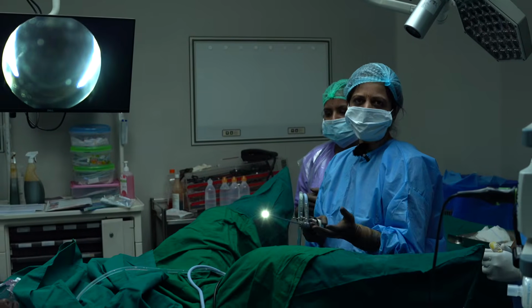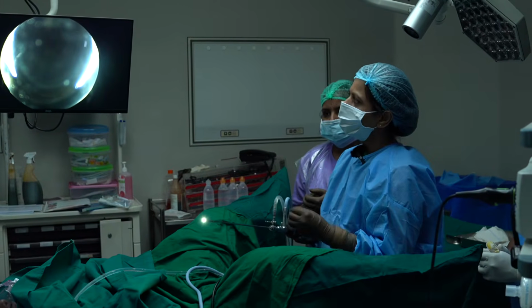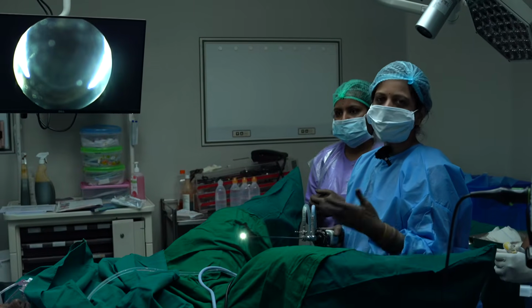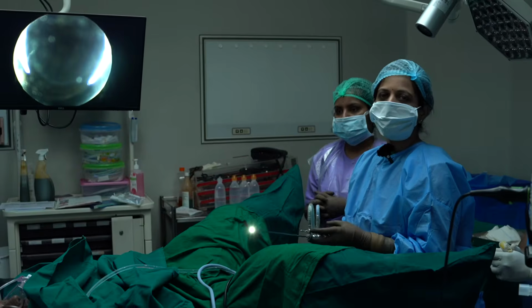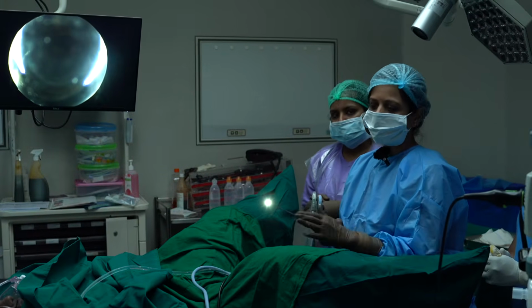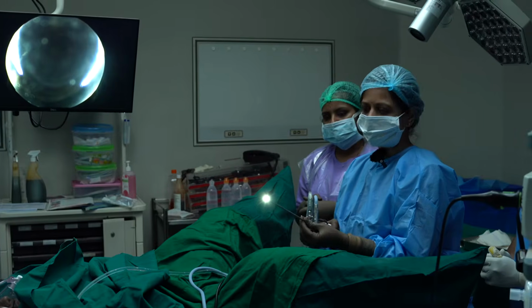uterine cavity. This is the screen where you will be seeing the findings of the hysteroscope, where once we enter inside the uterine cavity, if there is any pathology, you will be able to see it. This is the smallest hysteroscope which is available.